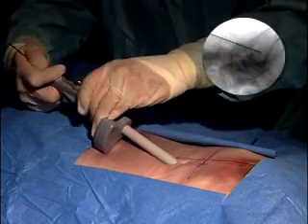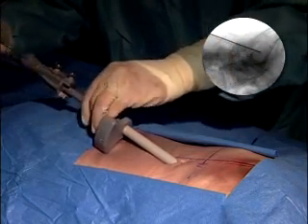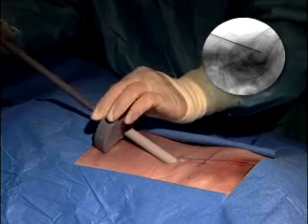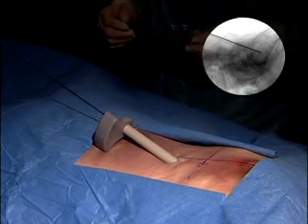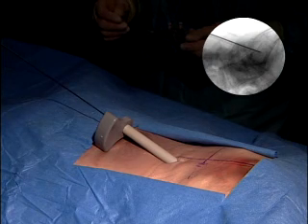After confirmation of the final placement of the outer dilator of the teleport tissue retractor, hold the flat distal handle in place. Remove the proximal handle. The first and second dilator will come out and remain as one unit.